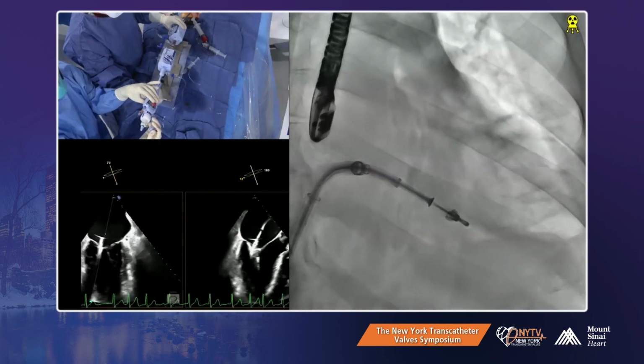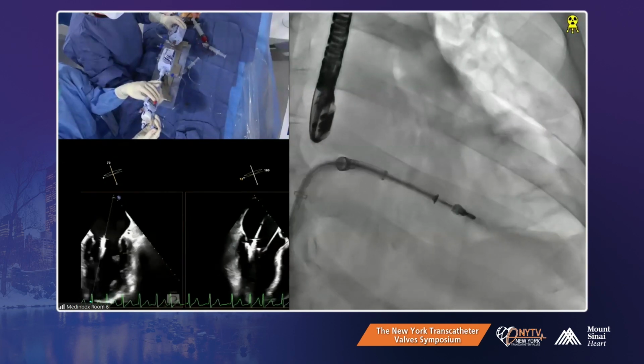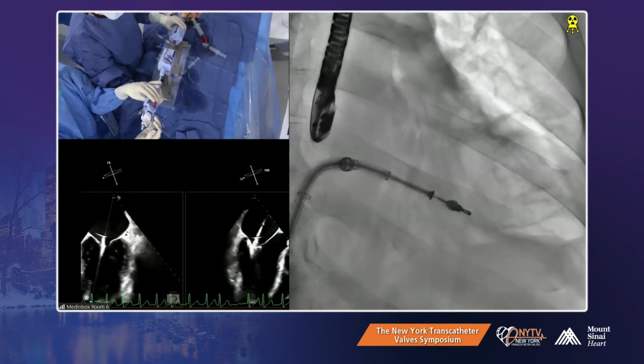No, anterior is not on. I think we're a bit buffed. You need to go down. Yeah, there you go. Now try this.